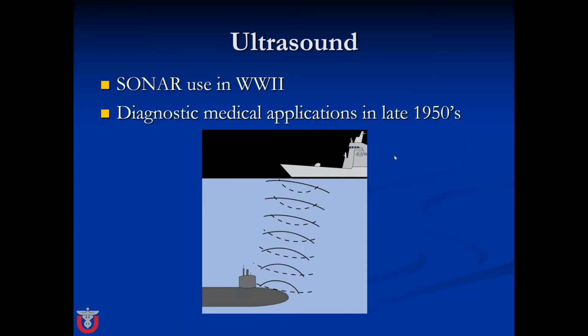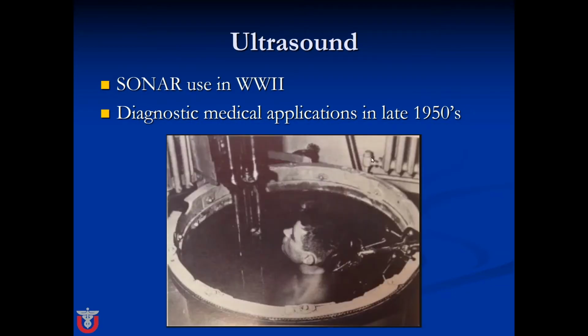Well, out of this came the idea that we could do a similar thing in a medical application. So it started in the 50s, and then this is one of the early ultrasounds where they actually had to completely submerge the patient. You see he has this head support here because he's being held down under the water, so the ultrasound beam can go through the water and bounce off of his organs.